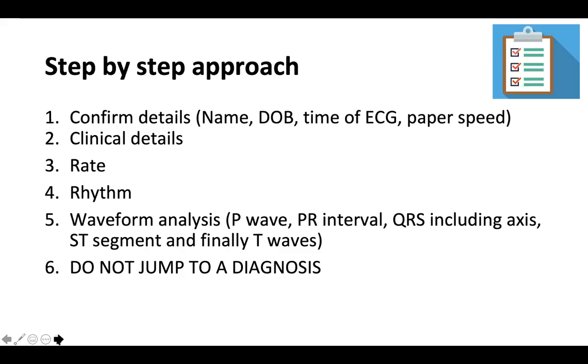And then how I like to do my next steps are looking at the rate, then rhythm, and then I analyze the waveforms, basically moving from left to right, and then coming up with an actual diagnosis at the end.